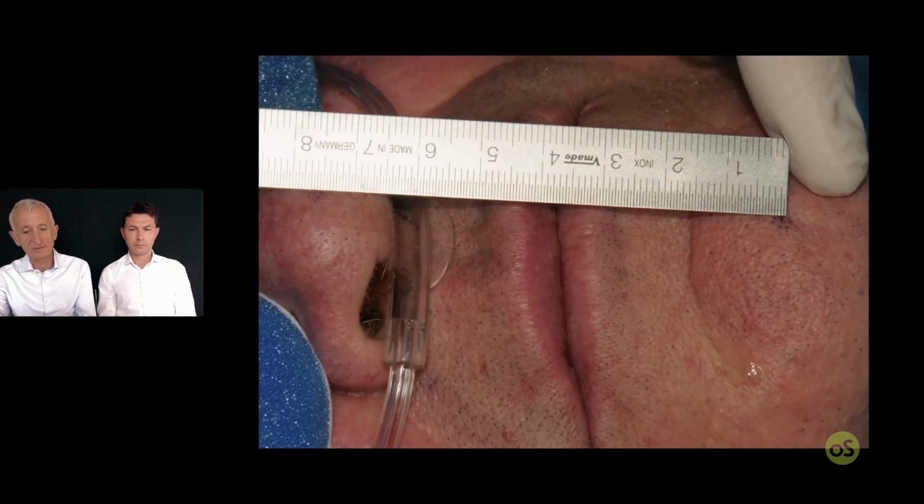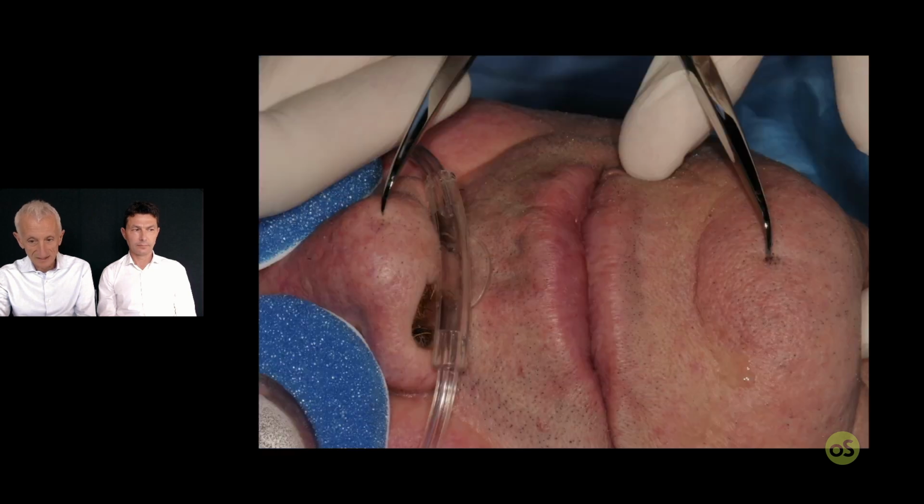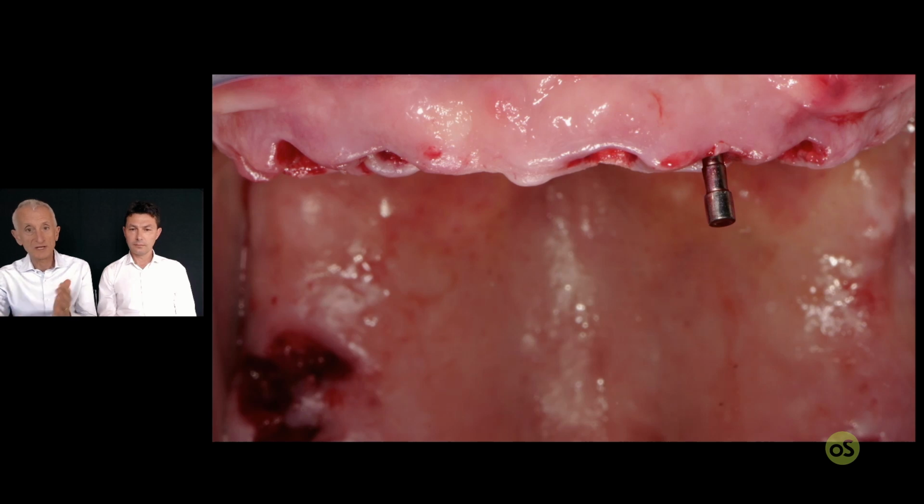And then I ask the patient to bite down, and I will check again, very empirically, the measures that I took before extracting the teeth. So vertical space and midline and so on. So once everything is fine, then I start to place the implants. You can place implants through guided surgery or through a freehand procedure, okay? So both techniques work.